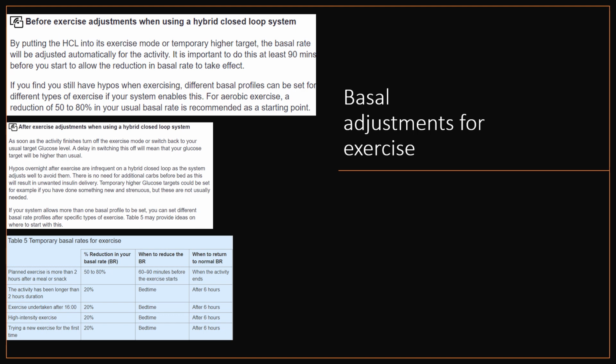Options for basal adjustment for hybrid closed-loop users vary according to the system. Alternative advice is included in the course and the hybrid closed-loop supplement. Alternative advice for managing exercise that can increase glucose is also provided for HCL users.